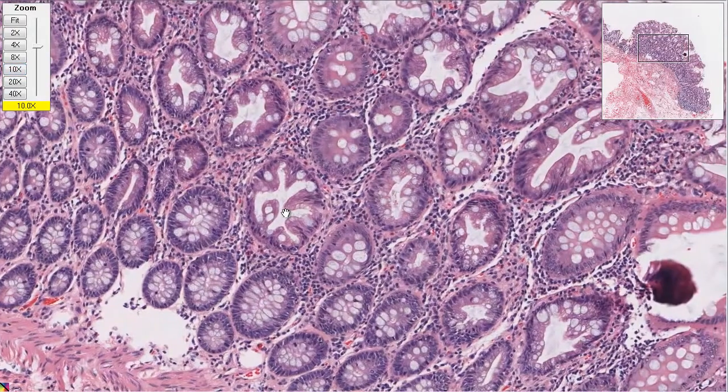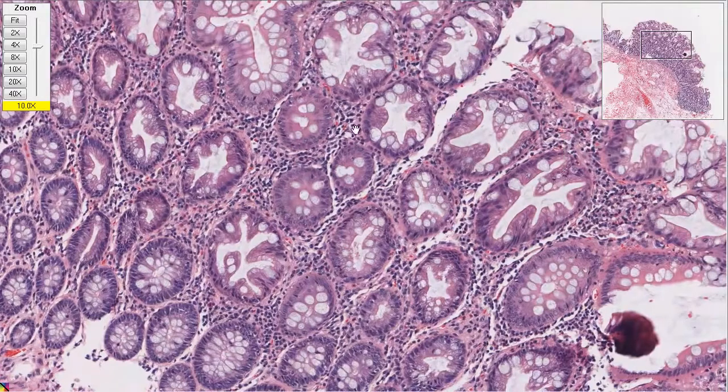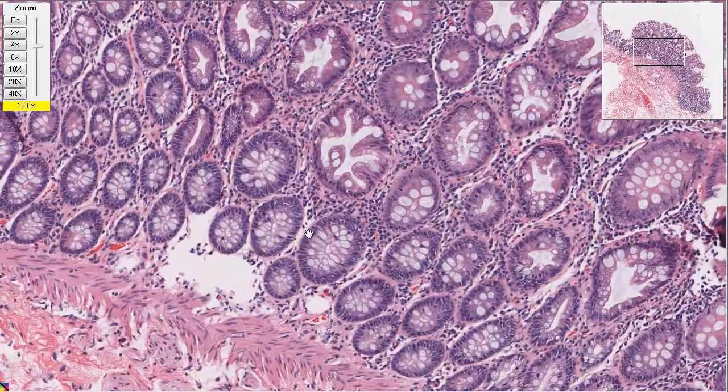Here, we would sign this off as hyperplasia. Hyper, like too much of something, and plasia means growth. So hyperplasia means too much growth. But the important thing is, if you took away the irritant, it wouldn't do this. If you took away whatever the irritant is, it would go back to being normal.